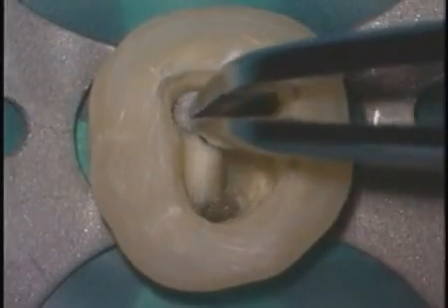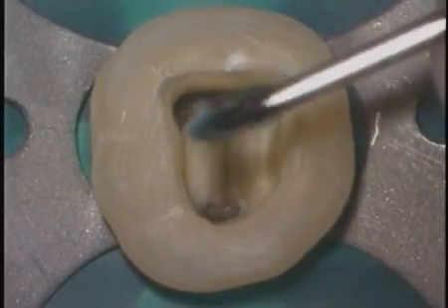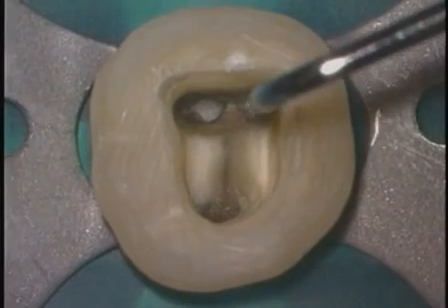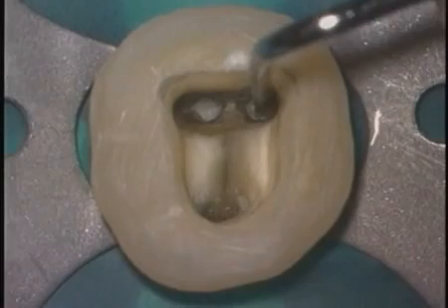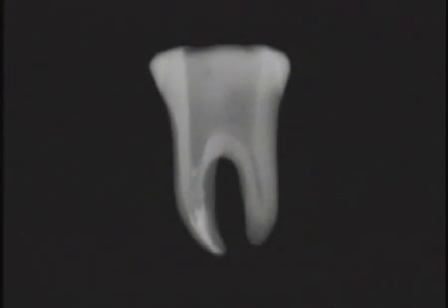MTA requires 4 to 6 hours to set brick hard and requires moisture to accomplish this reaction. We'll have moisture out on the PDL side, but we also need moist cotton pellets on the material on the coronal side. So here we are putting in moist cotton pellets and packing them down gently on top of the MTA. We dismiss the patient, and theoretically, anytime after 4 to 6 hours, it would be appropriate to have the patient come back. Ultrasonics delivers the MTA with remarkable control, and you can see this clinically and radiographically.